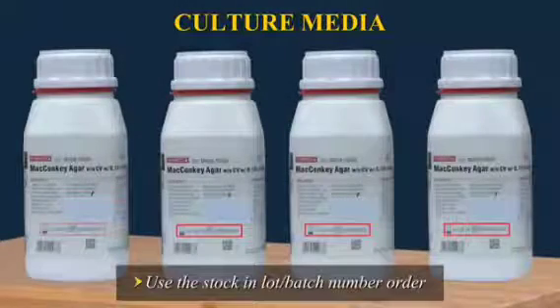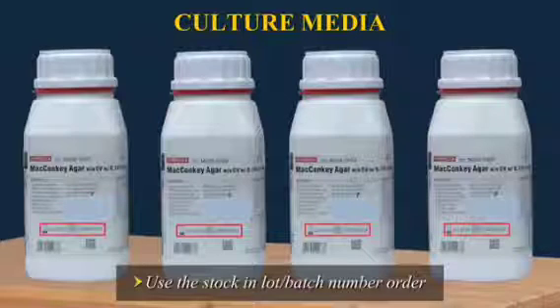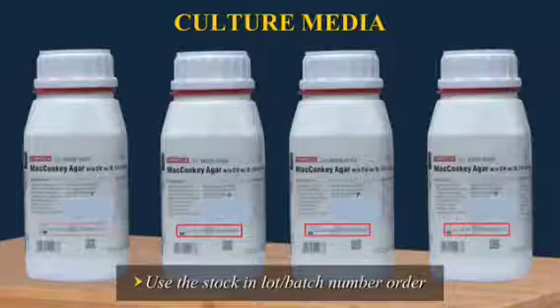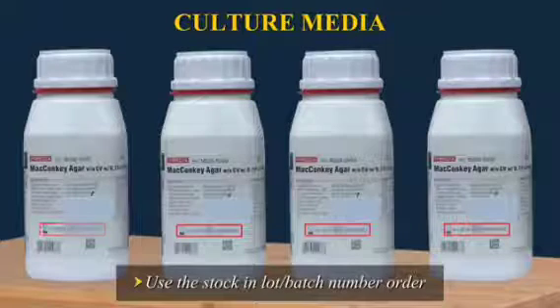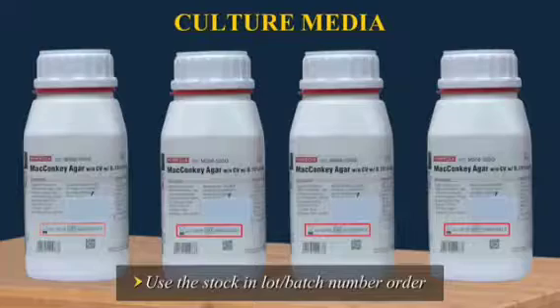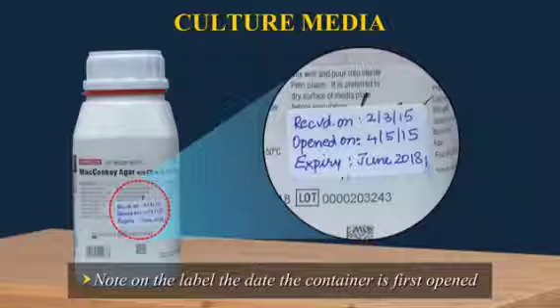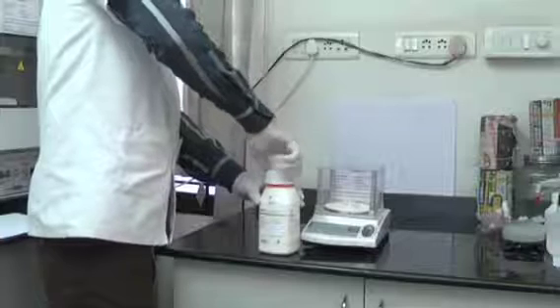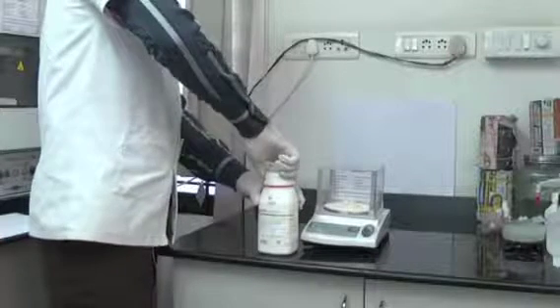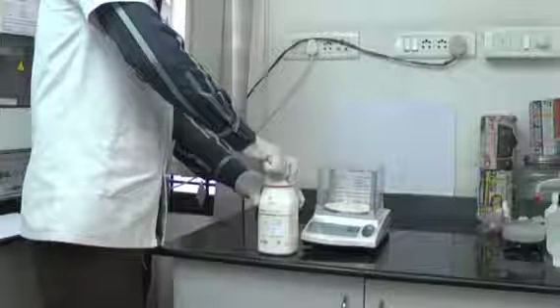Use your stock in lot or batch number order, that is, the product with the earlier lot or batch number should be opened first. Do not open a new bottle until the previous bottle has been emptied. Note on the label the date the container is first opened. After use, make sure the container is tightly closed and return it to the designated storage area.